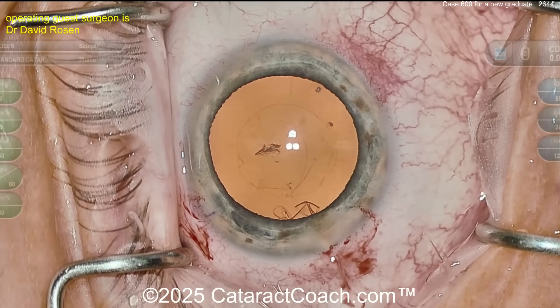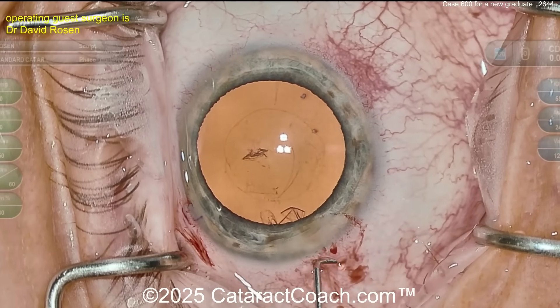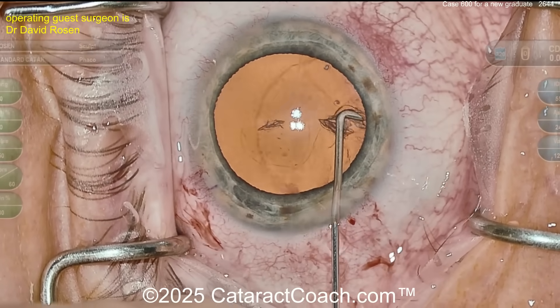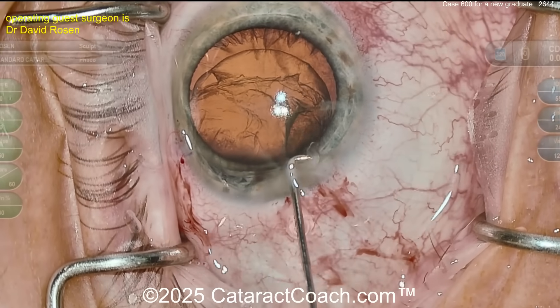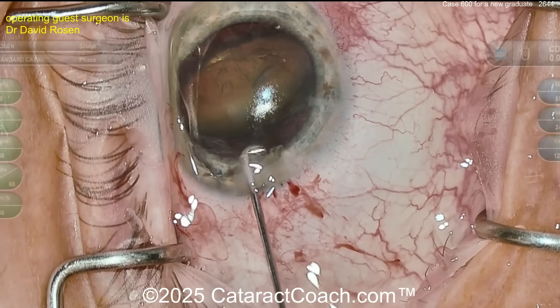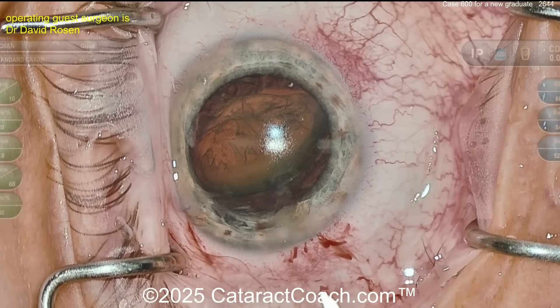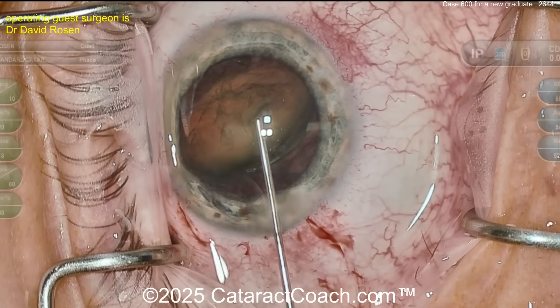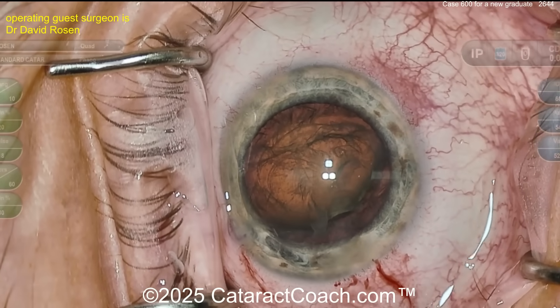Now let's see hydrodissection with a 27-gauge cannula — a specialized, maybe Chang cannula. A little burp of viscoelastic, pretty good. There's a fluid wave, another wave, another wave. The nucleus is partially prolapsed — I like that. Tilting it up, flipping it over — look at that, tilt and chop, flip and chop. I like it. A little extra aliquot of viscoelastic to protect the cornea — I like that too, very nice.